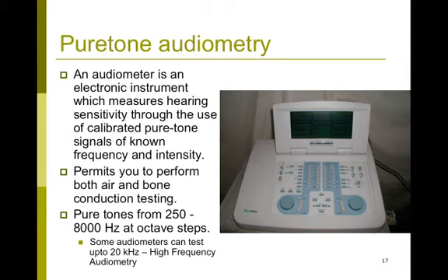Some audiometers might have the facility to test high frequencies, all the way up to like 20 kilohertz, specifically known as high frequency audiometry.